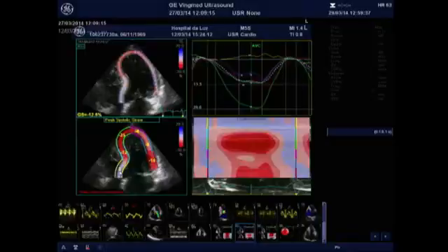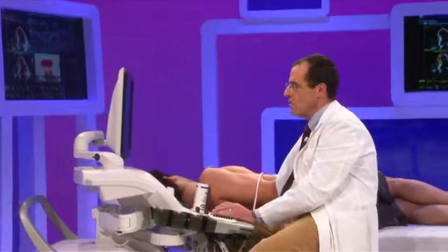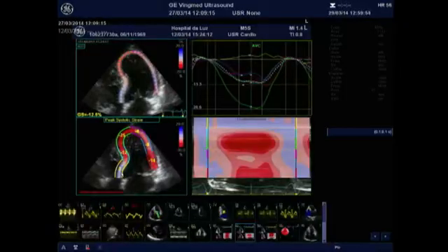Let me remind you that this patient had an ASA, an alcohol septal ablation, and perhaps it was in this place where there is almost no myocardial deformation. It's -2, which means that there is a scar there corresponding to the place where the alcohol septal ablation was performed. There are other segments, specifically in the lateral wall, with very low longitudinal strain values, below -10.